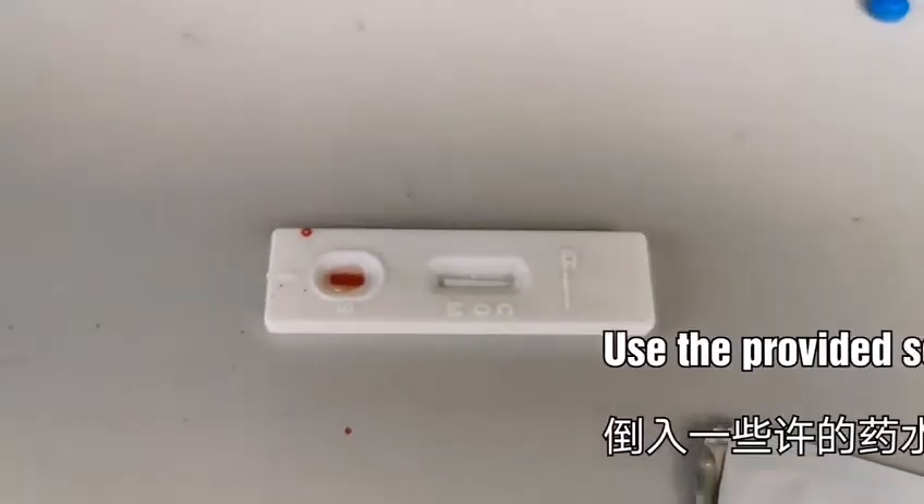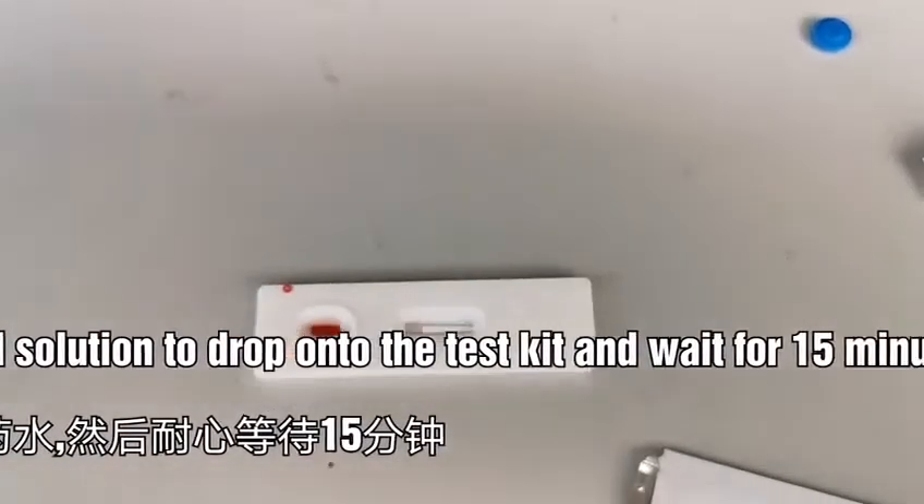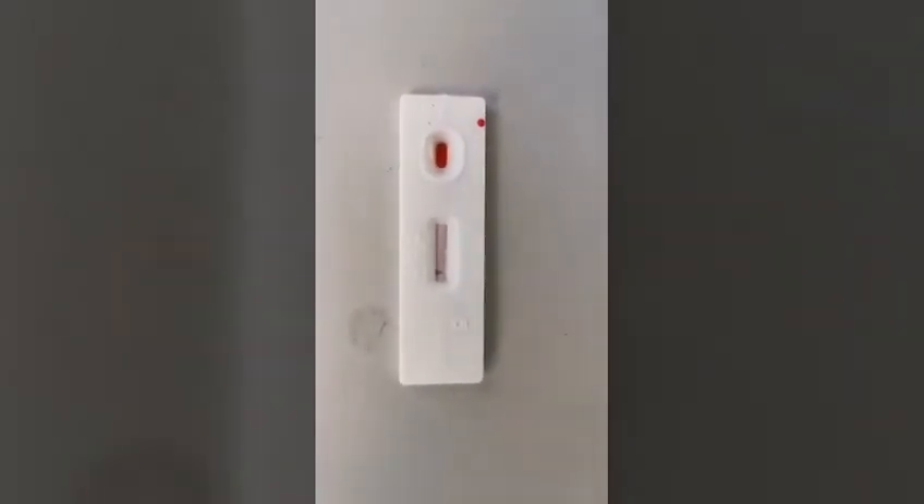Wait for 15 minutes. I'll show you in the video — we'll fast forward the 15 minutes. This test is actually negative. Congratulations.